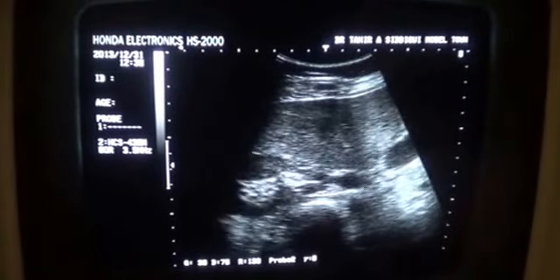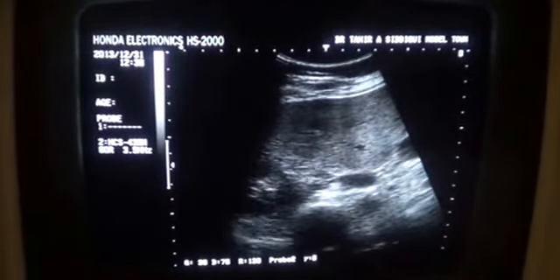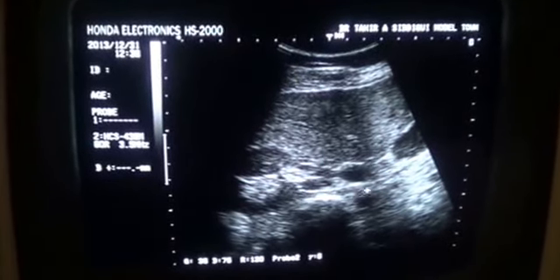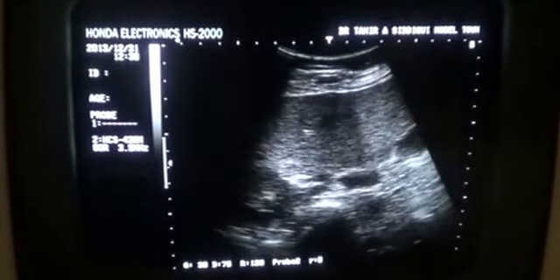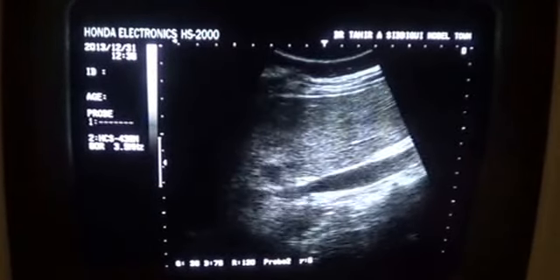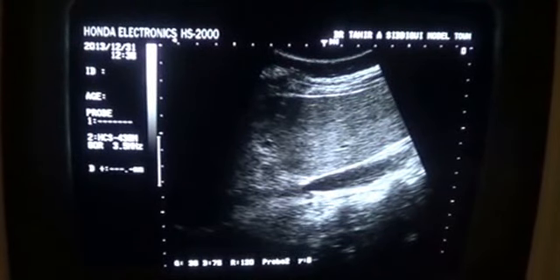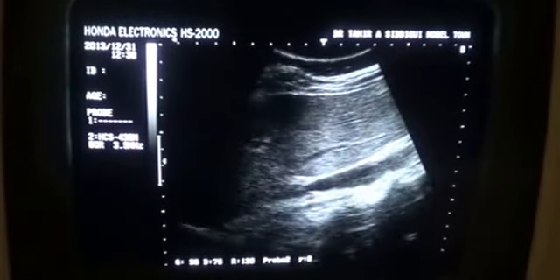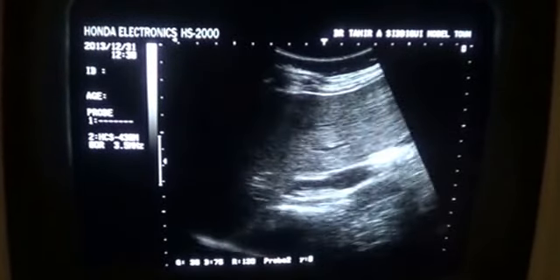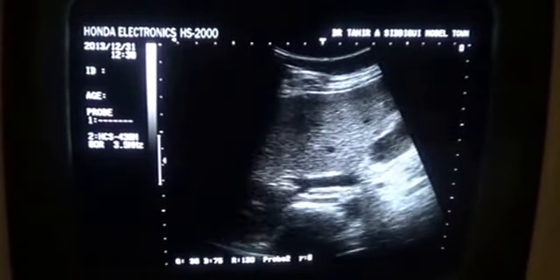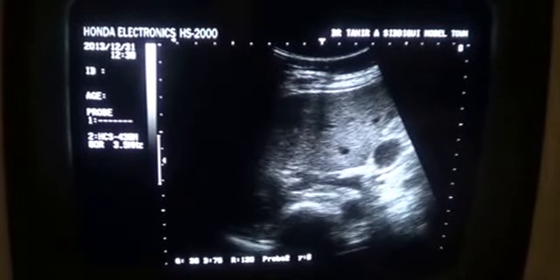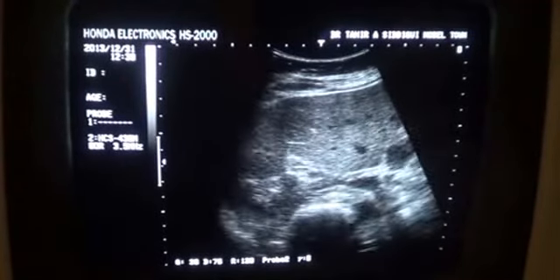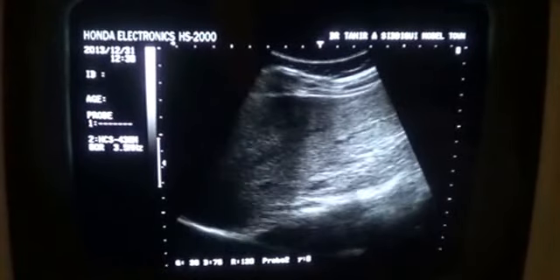Here we have an even clearer view — this is the right renal artery and this is the IVC. I'm going to perform the same maneuver again: this is the IVC, this is the right renal artery. Let's see if it enters the kidney.